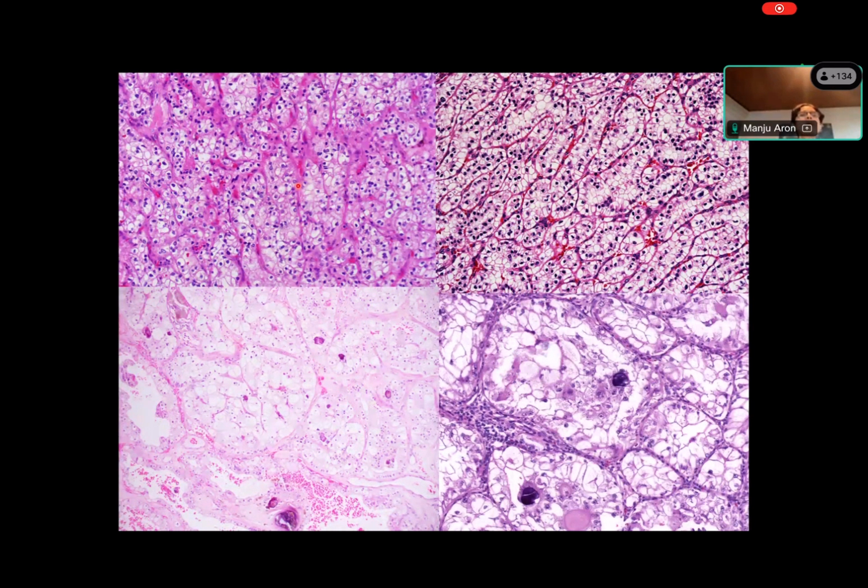Here you have these nests which are much more compact, and you can see this filigree-like framework of small sinusoidal capillaries. So this is more like a sinusoidal pattern, and here you have these expanded nests again, which are partially circumscribed by a capillary network.